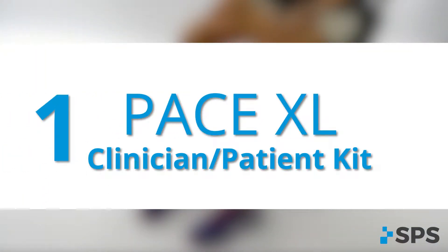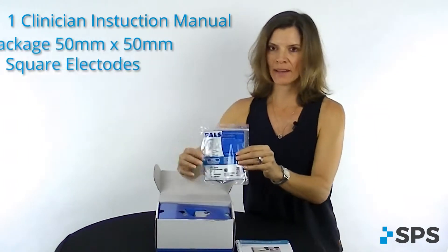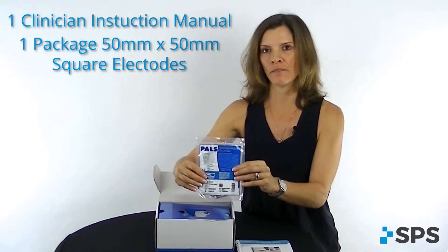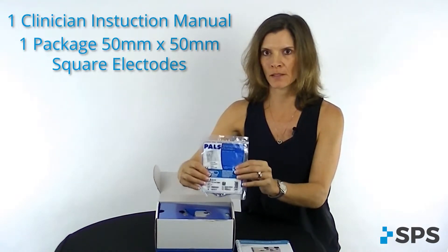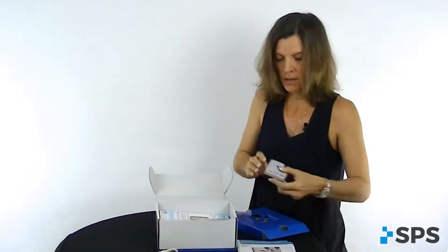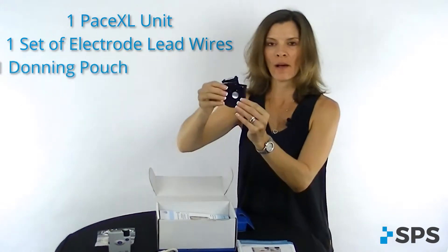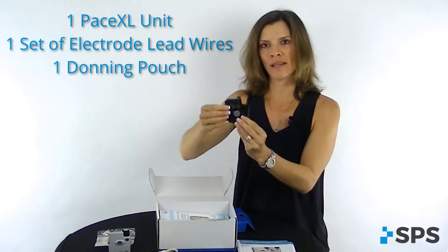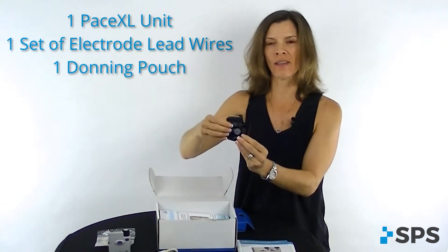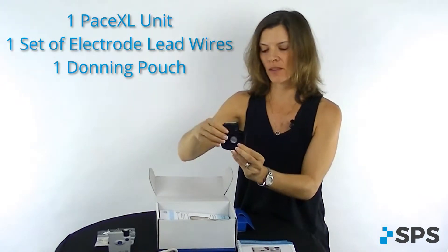The first box we're going to go through is the PaceXL clinician or patient kit. Inside the kit, you're going to have a clinician instruction manual, a package of PaceXL 50 by 50 millimeter square electrodes, a carrying pouch, the PaceXL unit, some electrode lead wires, and a pouch that covers the PaceXL unit when the patient wants to don this at their waist or on the strap that goes on the leg.